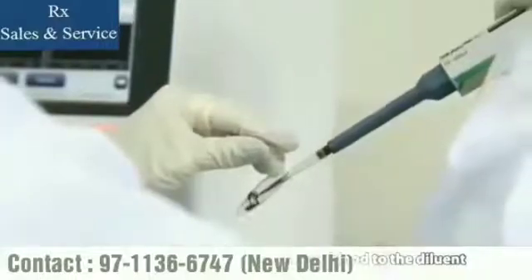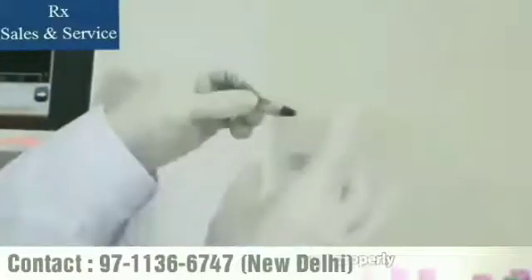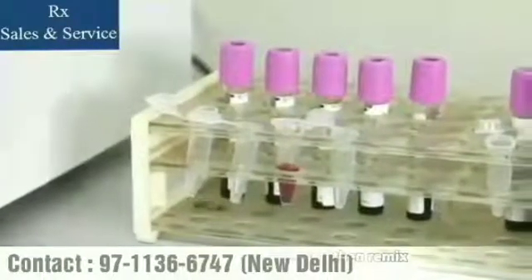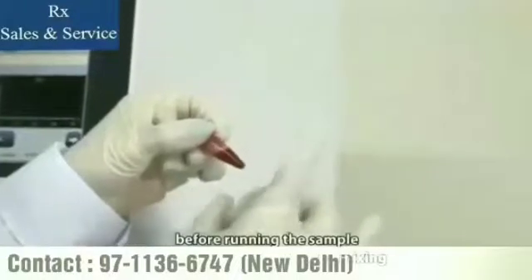Add 20 microliters of capillary blood or venous blood to the diluent. Close the tube cap and mix it properly. After mixing the capillary sample with the diluent, be sure to wait 3 minutes and remix it before running the pre-diluted sample within 30 minutes after mixing.